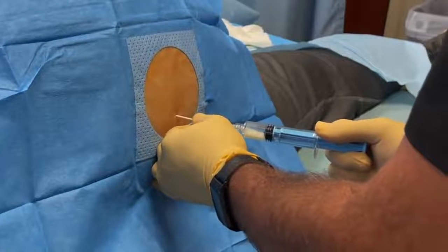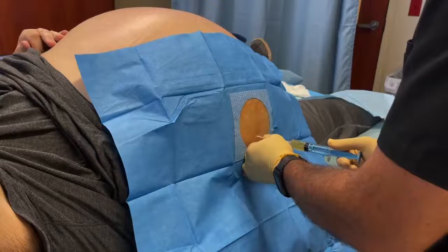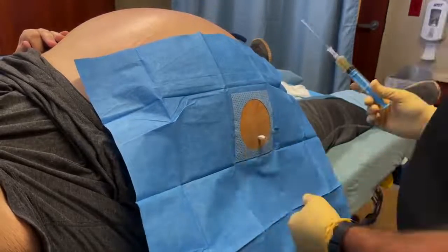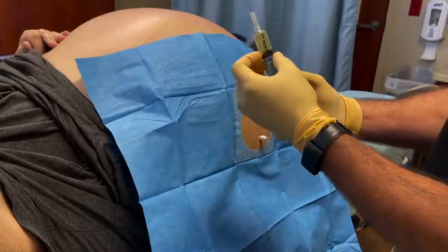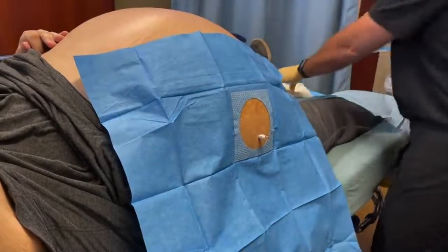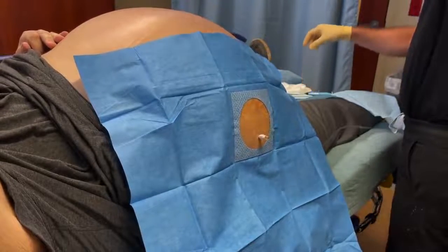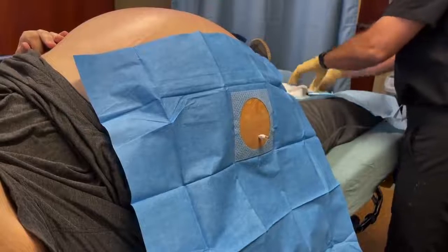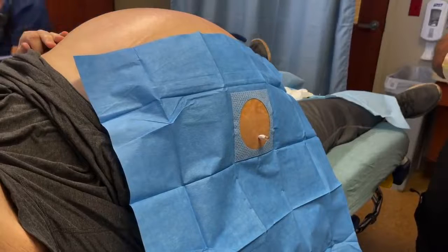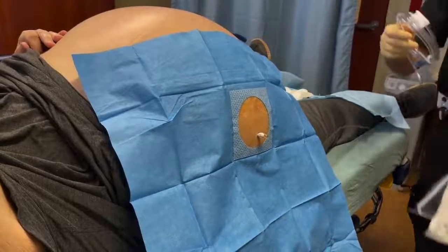And there's some fluid there, just the pressure. And there it is. So a little long. And then we introduce the rest. The fluid is nice and clear, maybe a tiny little bit cloudy, but certainly not thick. Go ahead and go to the suction side and hook it up to the suction wire. You need to connect the suction, start it on.